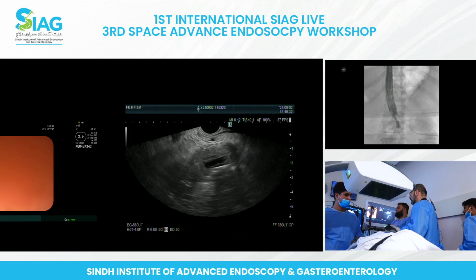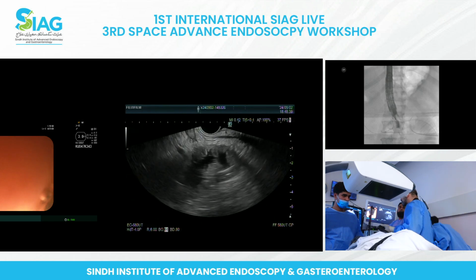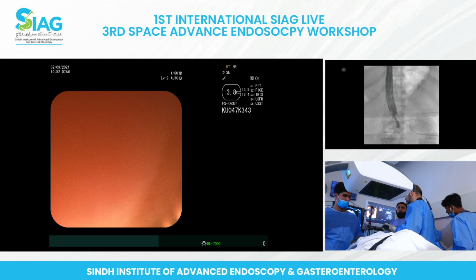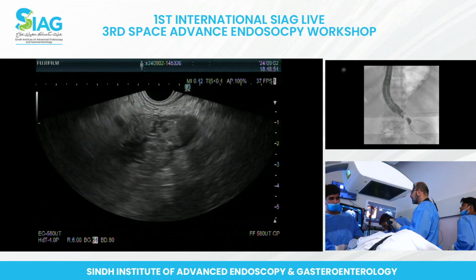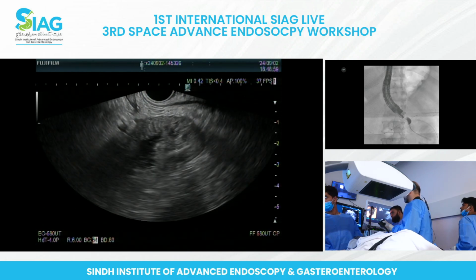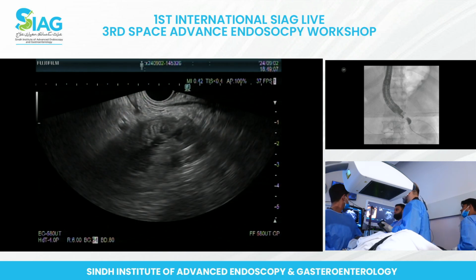Yeah. So the problem is, how does the fluid stay in the small bowel? Well, we flood it. In Japan they have a double balloon. That's what I was thinking, because I'd seen that somewhere, I couldn't remember. They have a device, the way the catheter has a balloon, and the filling is, if you had a balloon which would fill not distally but proximally, and then you could actually use that. Yes.